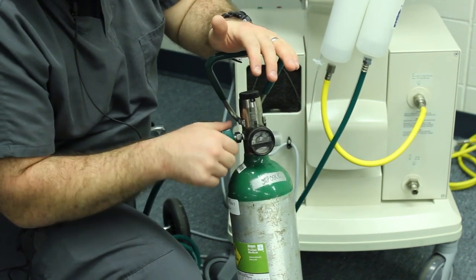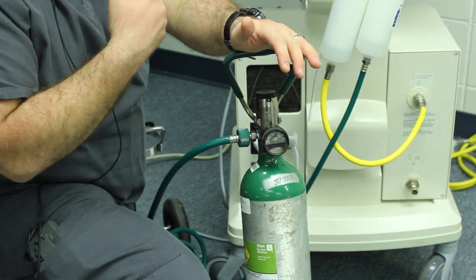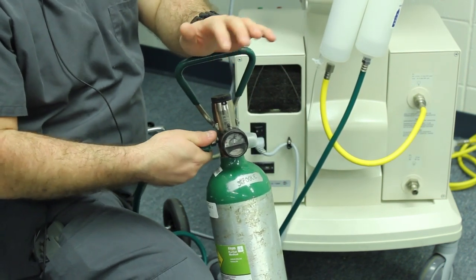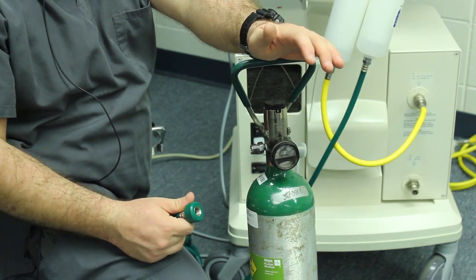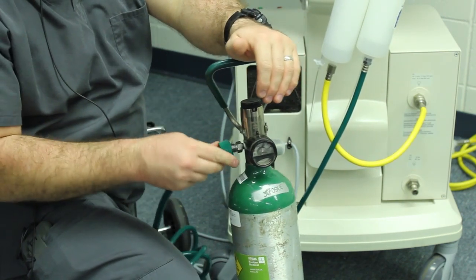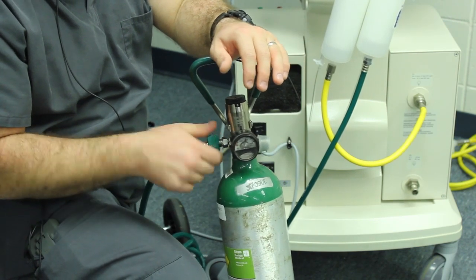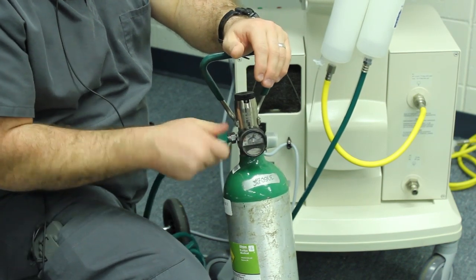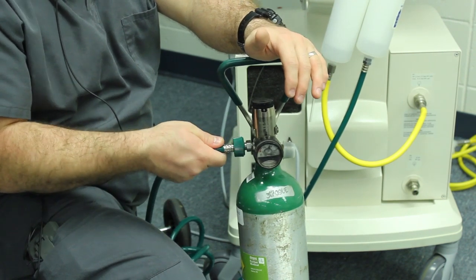Once you screw it in until it stops, you've pressurized the ventilator with oxygen and air — that's really what you have to do. What I strongly recommend is that after each use you screw this thing off, because if you don't, it will slowly leak and run your tank dry. If your tank runs dry, have somebody bring it to the union and I'll get you another one — we just swap them out. Screw it in until it stops hissing and you're where you need to be.